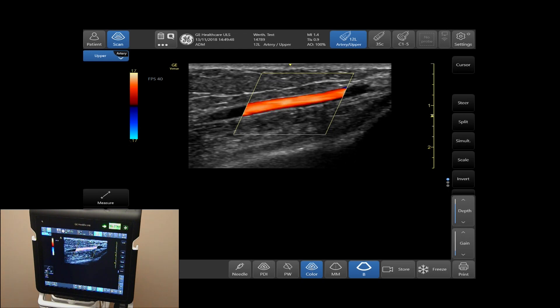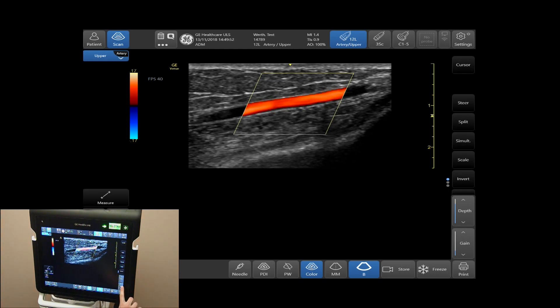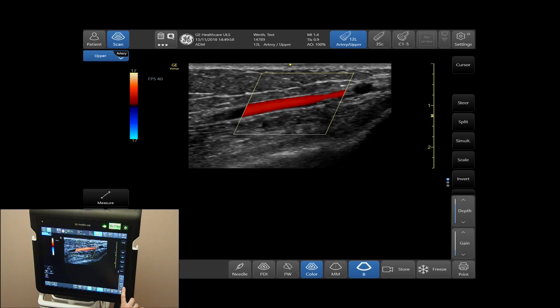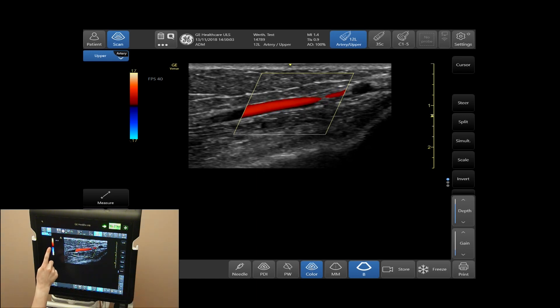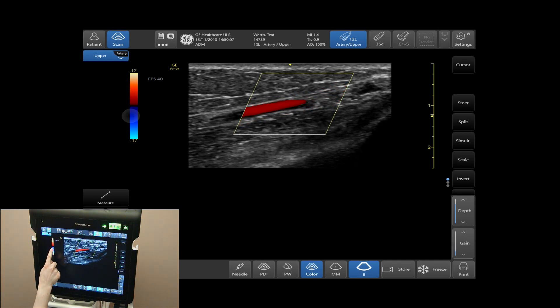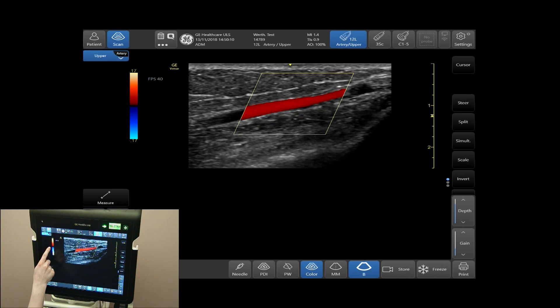To adjust your color gain, use your color gain sidebar to increase and decrease your color gain. You can also do this by using your finger and dragging up and down. This will increase and decrease your color gain as well.